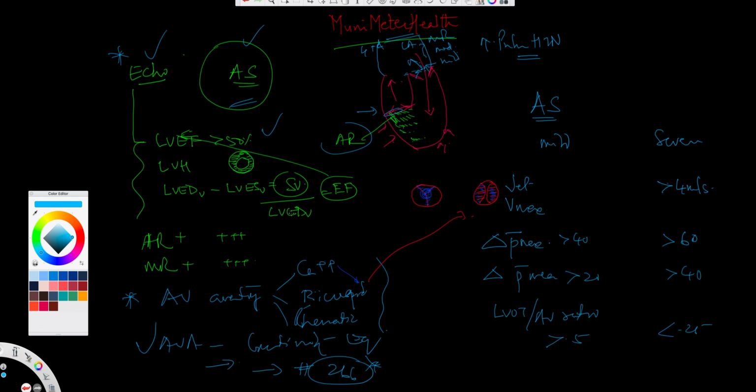Stroke volume is important, and you need to tell the surgeon if it's a calcified valve, if he's repairing it or she's repairing it. So it's very, very important. Also, you need to know how much was the severity, because obviously the severity has to be looked at first before the patient can be referred over. So severity, you look at all these parameters here and then decide whether these patients can go for surgery, etc. in this category. Okay, and pulmonary hypertension, sometimes if it is present, then that could be irreversible, and if it is irreversible, then that is not a case for aortic stenosis. So anyway, a lot of things that we can discuss during this segment, but the whole idea is wanting to tell you how the echo examination really is helpful for evaluating the aortic stenosis in our settings.